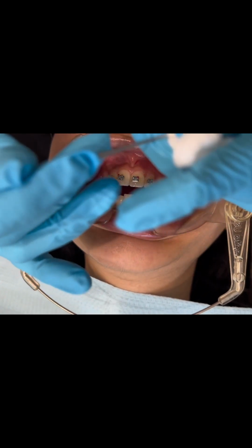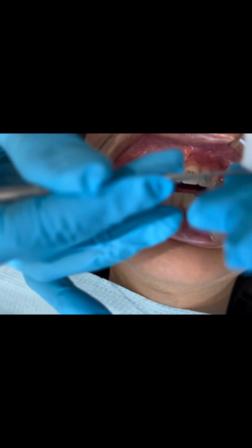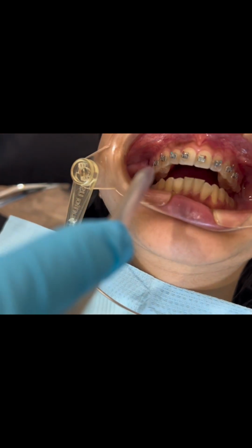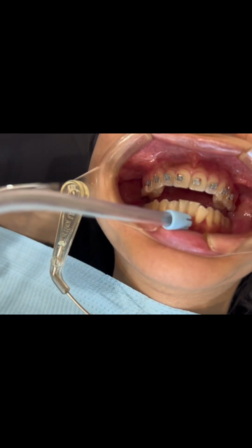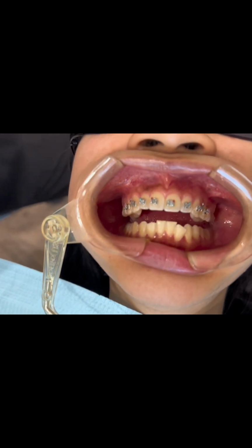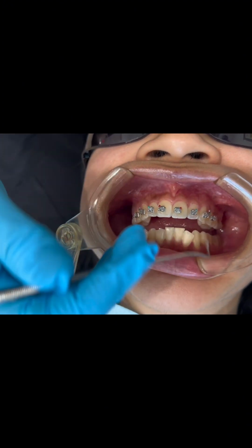You see? Just like that. Now we see that we're getting some buildup of water on the back, okay? So we're gonna suction the patient as needed. Notice I'm not getting anywhere near the bracket when I'm suctioning the patient because I don't want my brackets to get wet. The brackets get wet, it's over. Gotta start over. They have to stay very dry, okay?